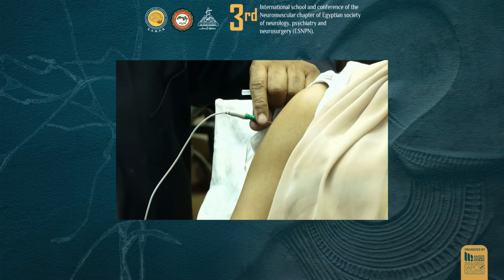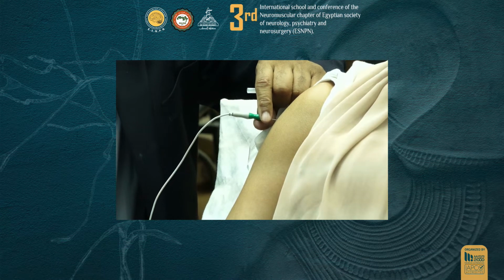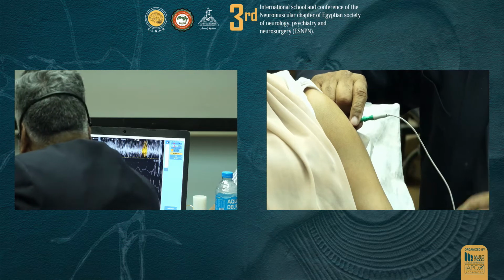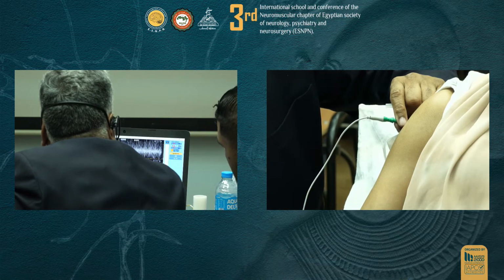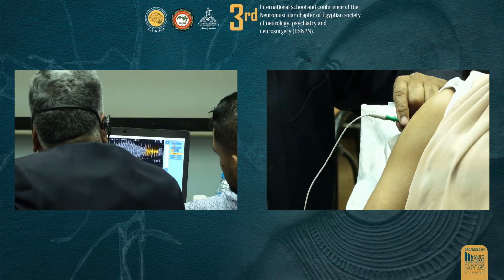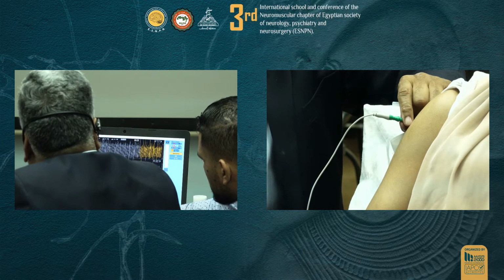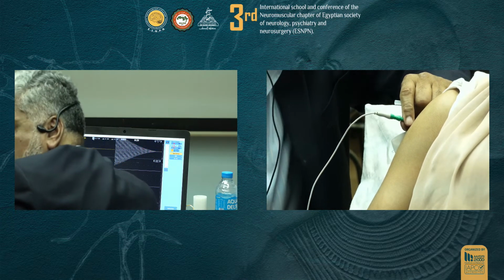Okay, just give me 1 second. Yeah, so whatever you can see, we'll see where the best use of it is, wasting time. I think we'll just show you what we can show you, and then I'll show you the examples there. So what's the sweep speed over here? Do it 100. Yeah, go to maybe 100. Okay, so I'll see what we can do. I'll try my best, and then I've got some videos that I can show you.